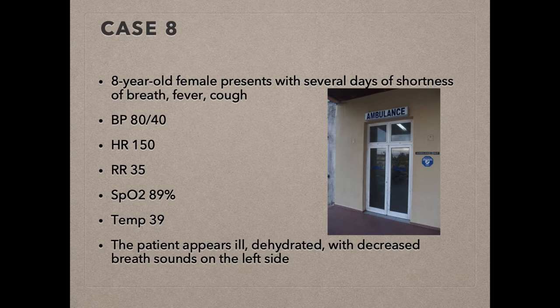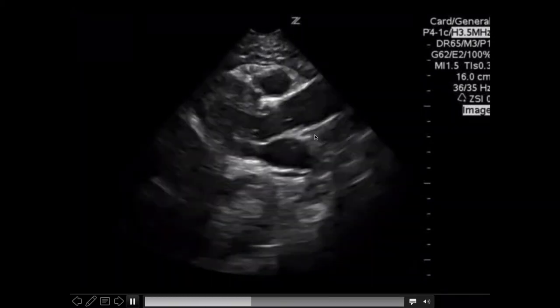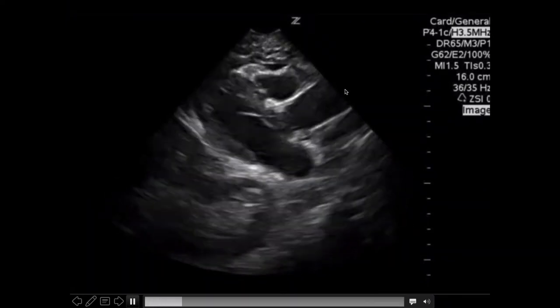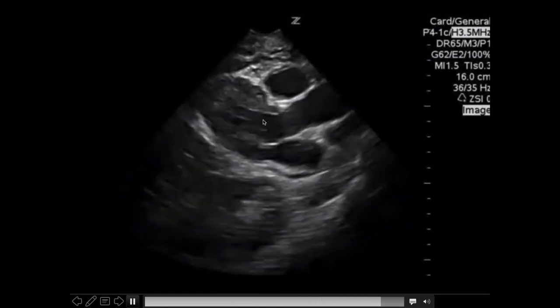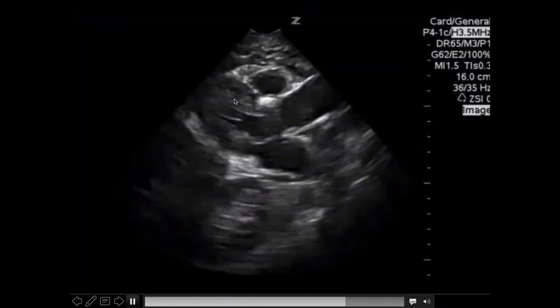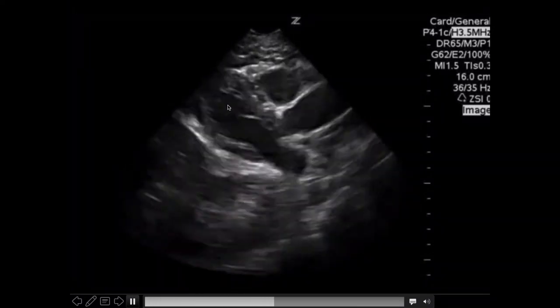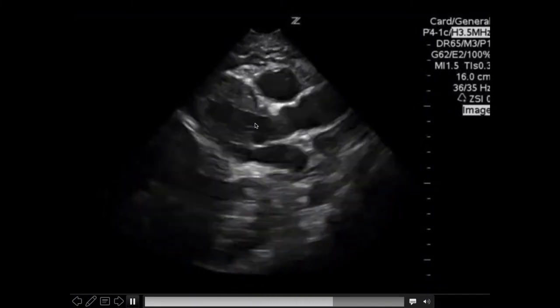Case number eight: an eight-year-old female presents with several days of shortness of breath, fever, and cough. Vital signs show tachycardia, high respiratory rate, low SpO2, and high temperature. The patient appears ill and dehydrated with decreased breath sounds on the left. Starting with the parasternal long view, we see the right ventricle, left ventricle, left atrium, aortic valve, and aortic outflow tract. The left ventricle function appears normal - actually maybe hypercontractile, where the endocardium touches and pushes out as much blood as possible. The anterior leaflet of the mitral valve is hitting the septum every beat.